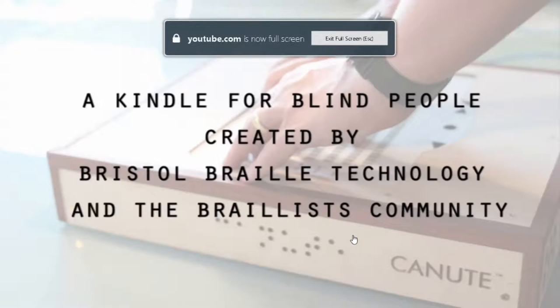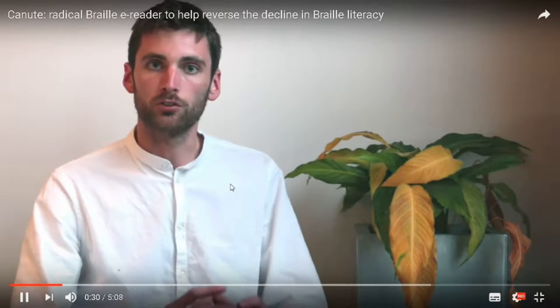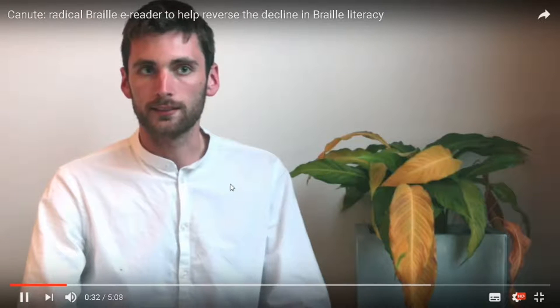Hello, I'm Ed Rogers, Director of Bristol Braille Technology, and we are working on the Canute. The Canute is a radical new braille e-reading device — it's like a Kindle for blind people. It makes digital braille far more affordable than anything that currently exists on the market by having multi-line braille, which means you can see a whole page of braille. It will cost hundreds of pounds rather than thousands of pounds, which the existing models currently cost.